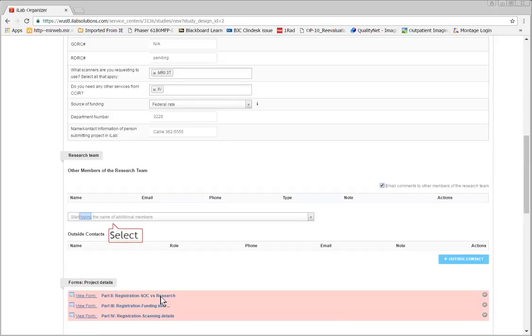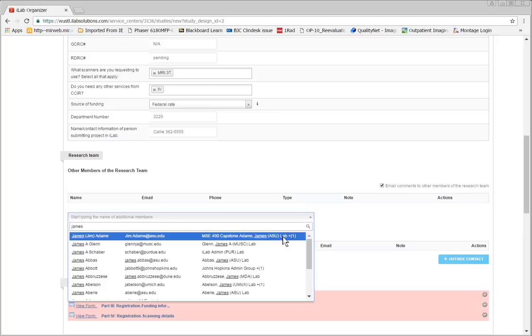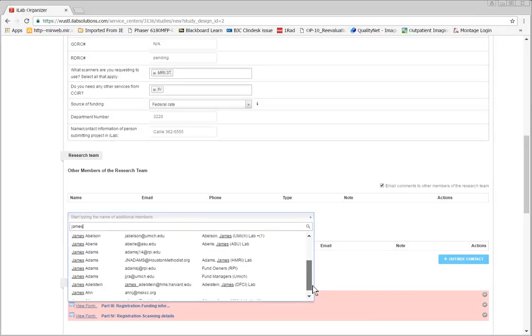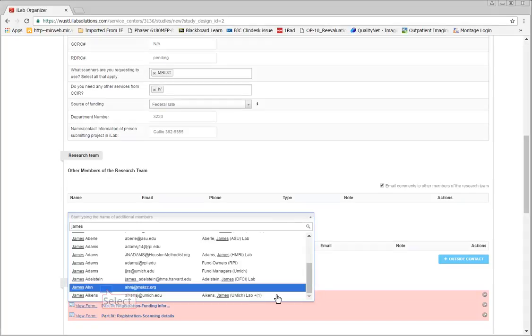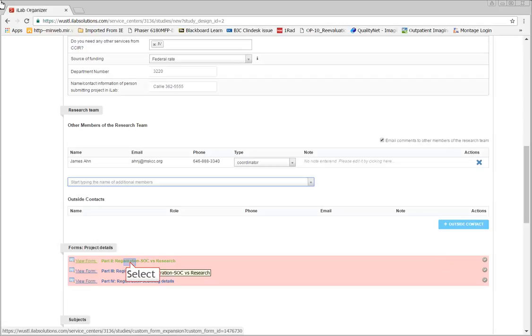Enter all team members that will be working with this project — this includes any schedulers or billing personnel. Then fill out the Project Details forms.